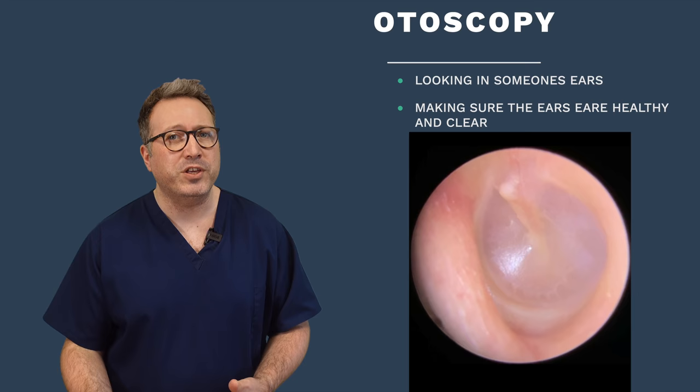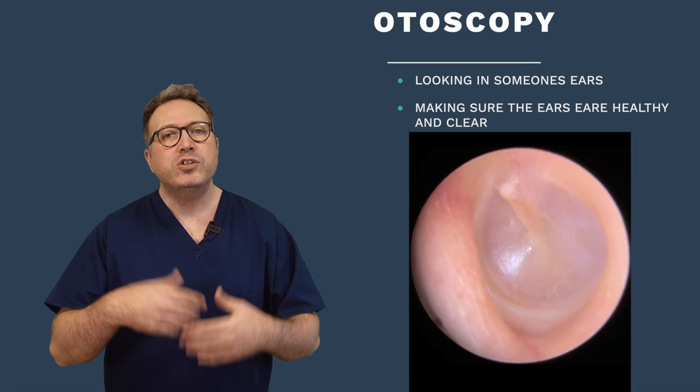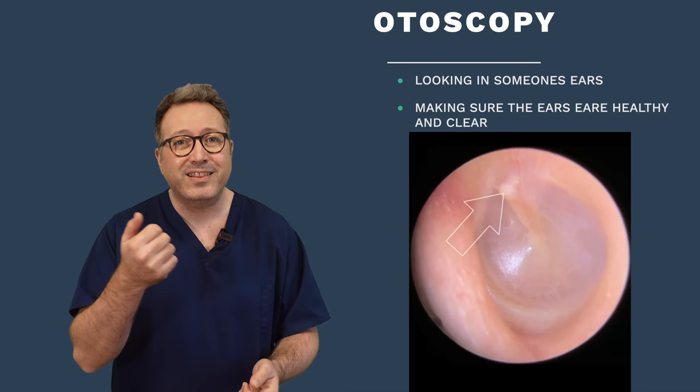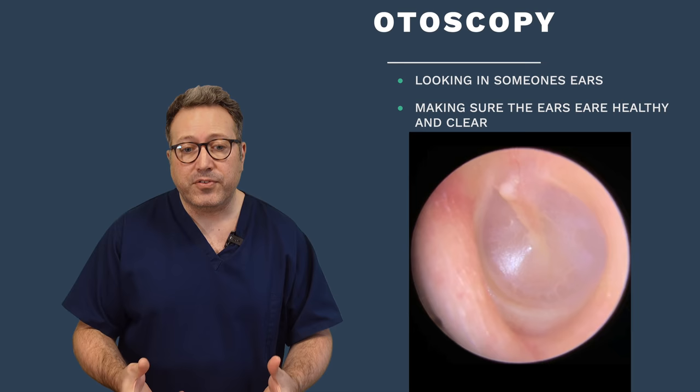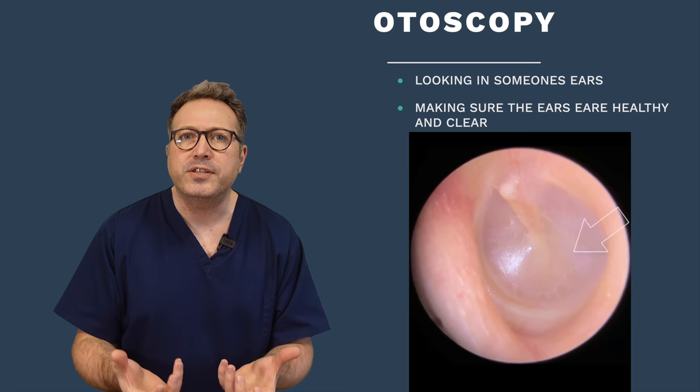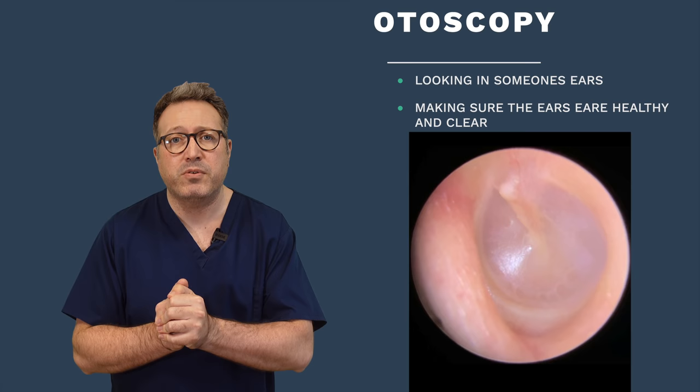Is there any history in your family? Is there any history with yourself of ear problems? So we go through a few questions first of all, just to get a bit of background about you and your hearing issues. Once that's done, we tend to then do a little bit of otoscopy. Otoscopy is the term we use for looking in someone's ears. We use an endoscope to do our otoscopy, but you can use what they call an otoscope as well, which is a little lighted lens that you can take a look in someone's ear with, which is what you normally have a look in when you're at the GP's.